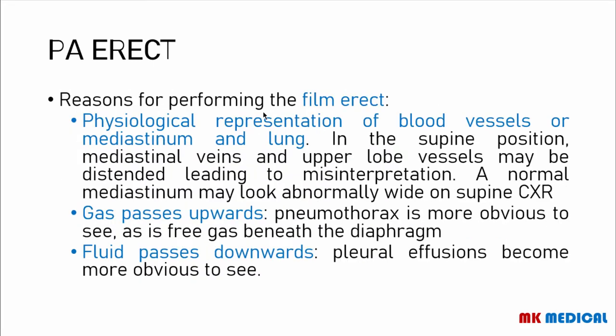The reason why we want to do an erect film is because we want to have a correct physiological representation of the blood, the mediastinum, and the lungs, like I already told you. If you have a person in the supine position, the mediastinal vessels, even the upper lobes, may be distended, so it may lead to misinterpretation of the x-ray, so it may not be in the normal anatomical and physiological representation. And of course, a normal mediastinum may look abnormal if the person is laying down. So that's one of the reasons why we order an x-ray when they are erect.